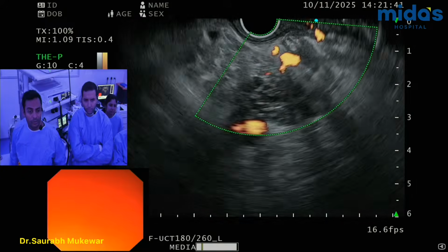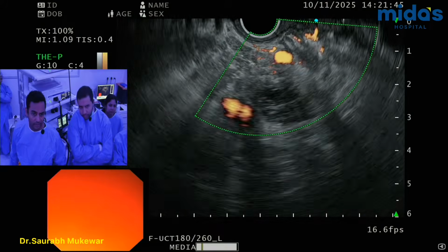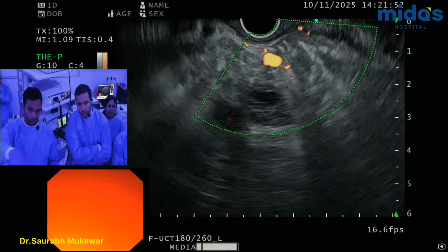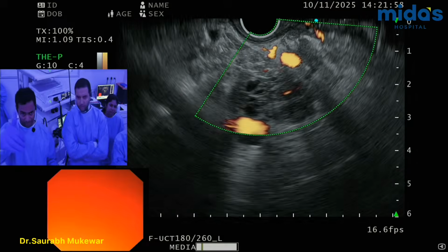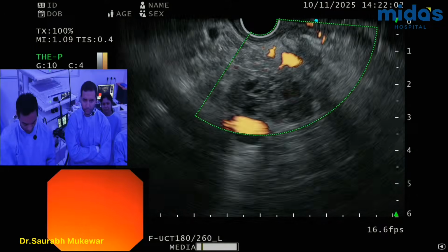And I have to avoid this vessel, which probably wasn't very visible then, which I may have hit. And there's something in the wall. Yeah. And then there's one. So we have to find a way. The wall I won't bother, but this one we should avoid. The big one, the bigger. Yeah, yeah. And it's right in our path. Right. So let's see. Try to do something. Okay, now needle, please.